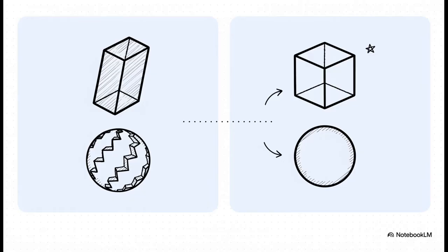And you know, how we actually shape those voxels matters a ton for image quality. Here's a great memory trick for your exam. ISO means equal, right? So isotropic resolution means the voxel has equal dimensions in every direction. It's a perfect little cube.